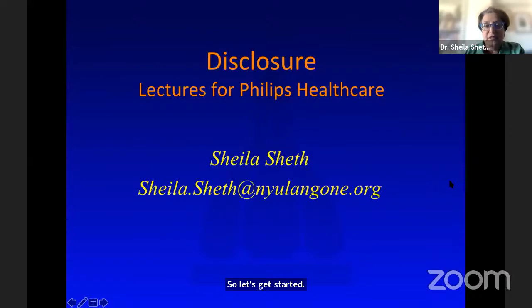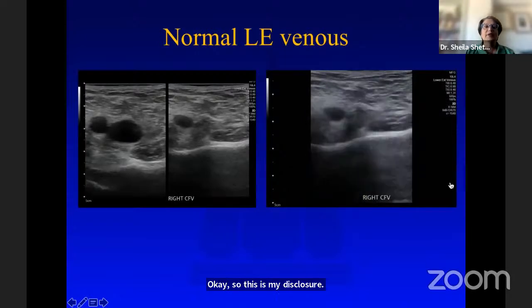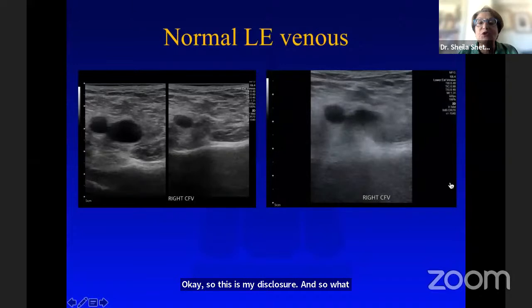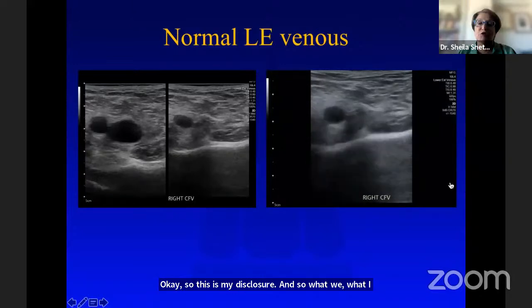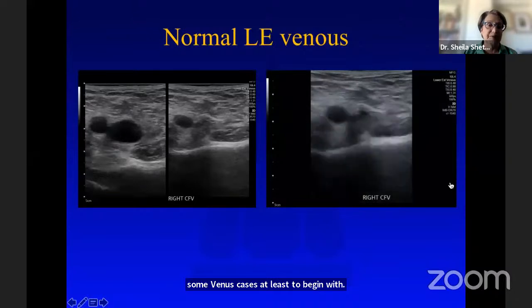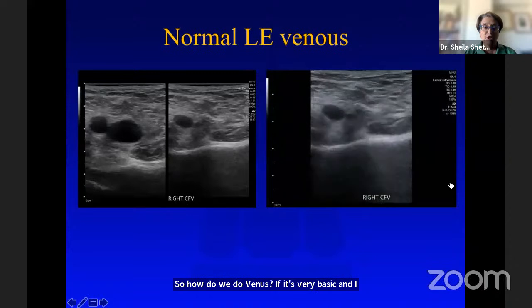Okay, so this is my disclosure. What I just want to review initially, because I'm going to show some venous cases, at least to begin with, is how we do venous ultrasound. It's very basic, and I apologize, but I think it's important to review this.